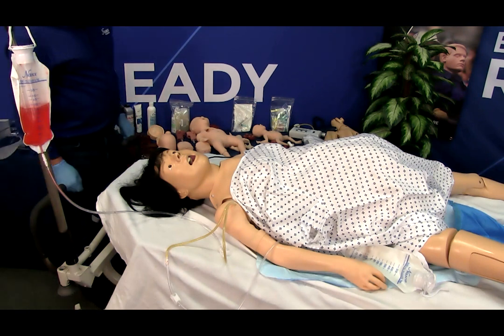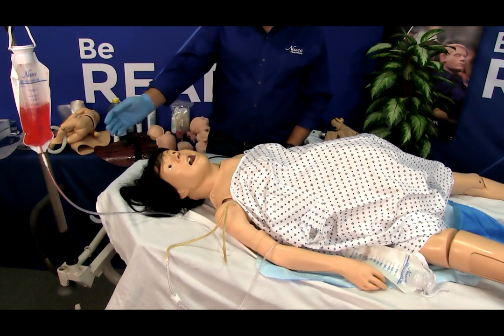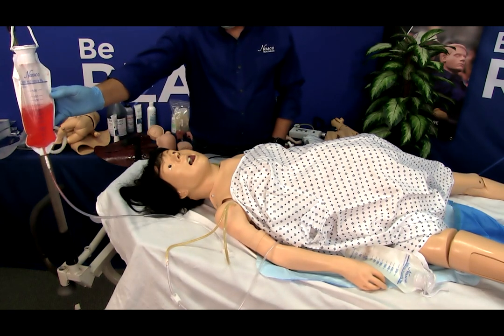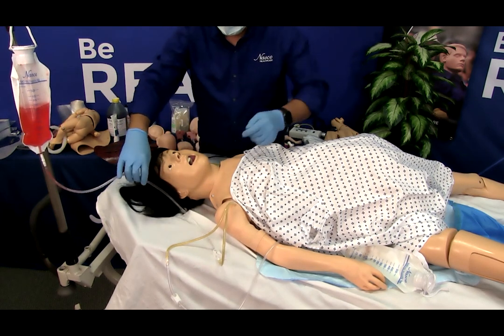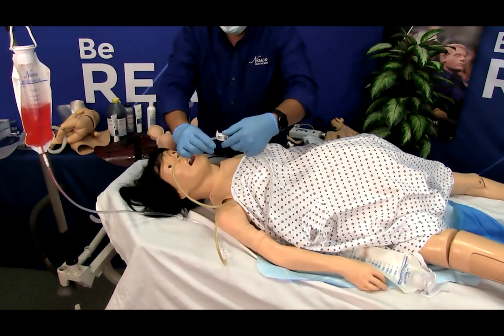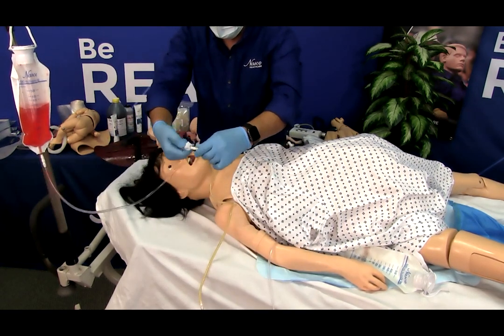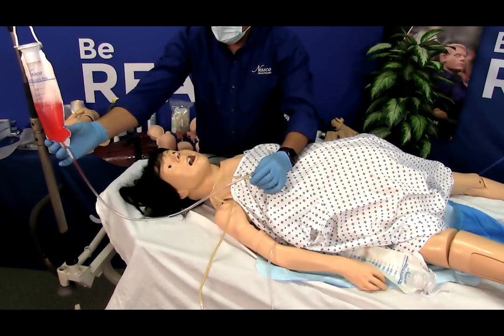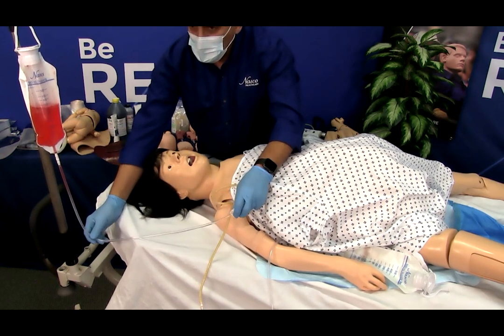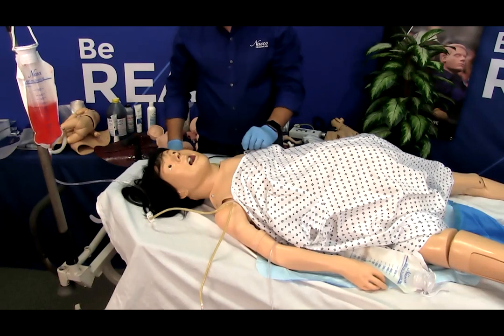To prepare the injectable training arm for use with Lucy, prepare the synthetic blood as instructed in the instruction manual. Before filling the IV bag, be sure the clamp on the IV tubing is closed. This will be IV bag A. Fill 500 cc's maximum. Be sure to hang IV bag A no more than 18 inches or 45.72 centimeters above the level of the arm.